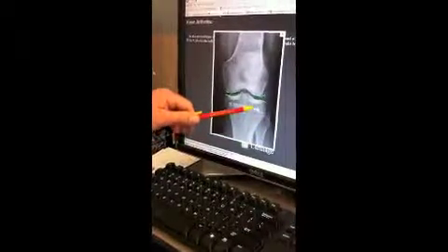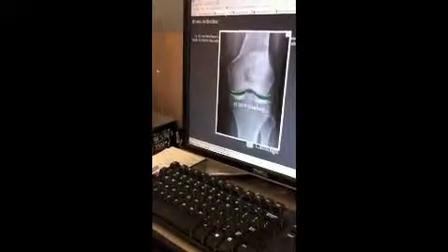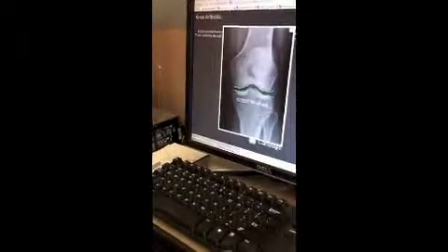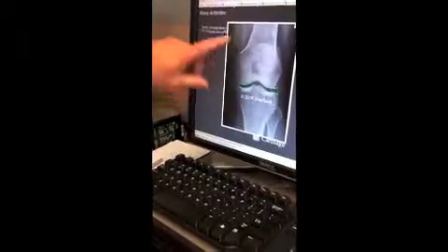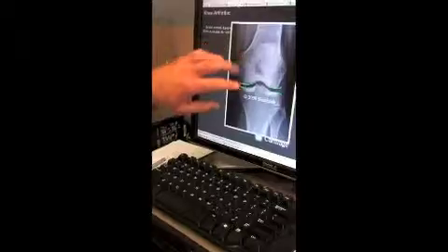You want the head of the fibula and the proximal tibia to have slight superimposition. You also want to be able to see some soft tissue around the knee joint and the bony details surrounding the patella on the distal femur.